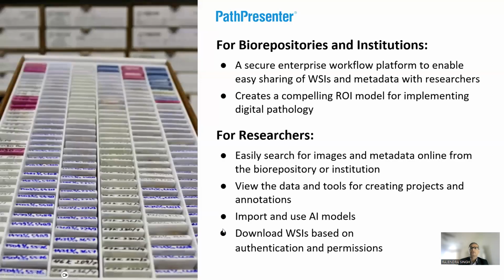So what we have created is a secure enterprise workflow platform that is completely owned by the pathology department or the organization or the standalone biorepository, where they can easily upload and share whole slide images along with the patient's metadata with researchers from anywhere in the world. This is a completely HIPAA compliant secure platform which allows the researchers to log in after they have the authentication and permission granted by the parent organization to come in and search for those images and the metadata, and then build their own folders with data that they would like to use for research.